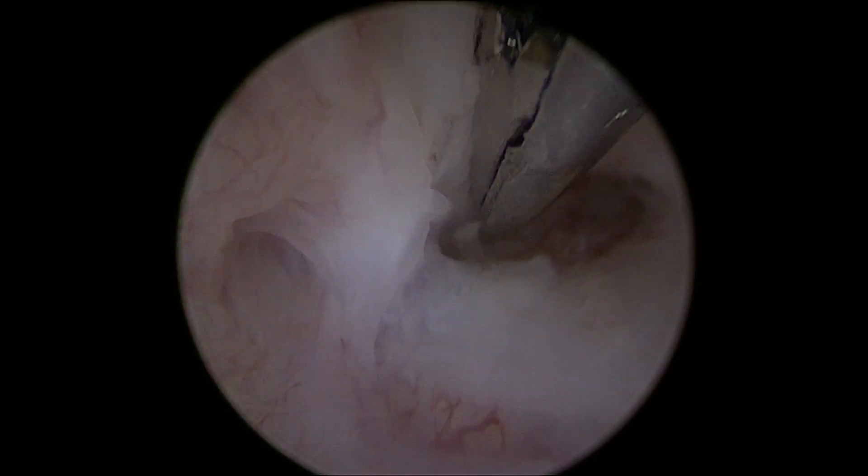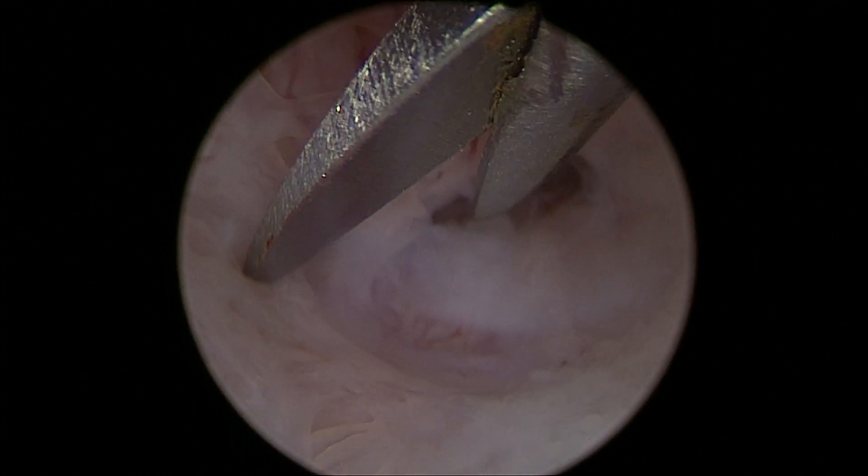You can use the scissors as a retractor, as an elevator. Here you can see the right plane to cut with the scissors — little cuts, millimeter by millimeter, always in the right plane between the anterior and the posterior aspects.